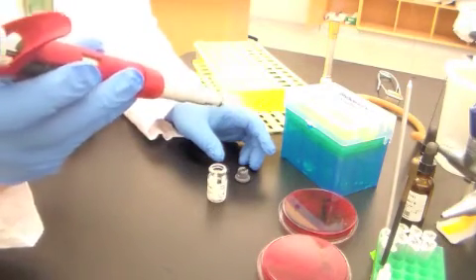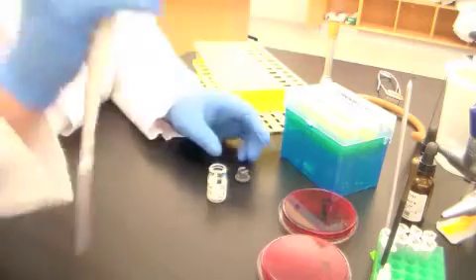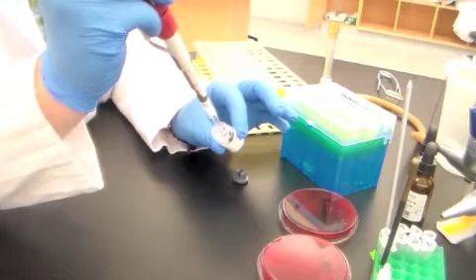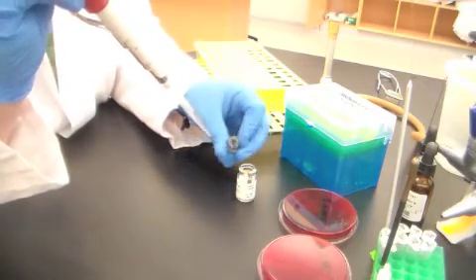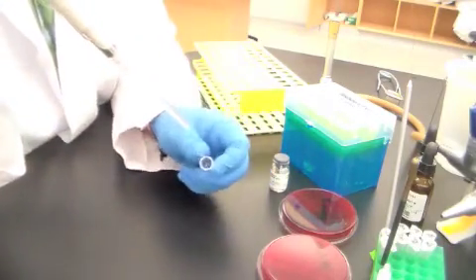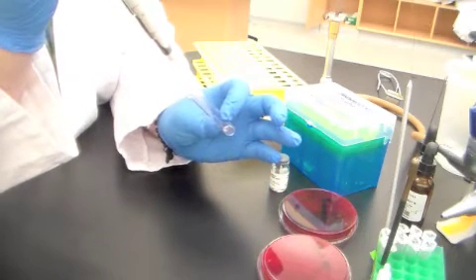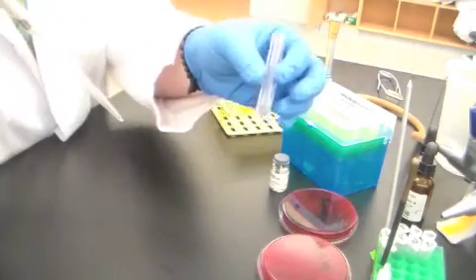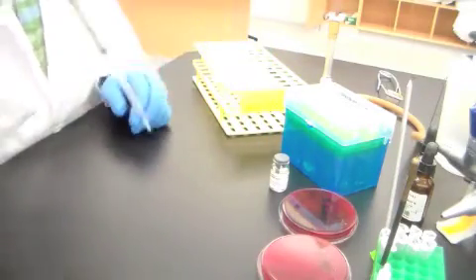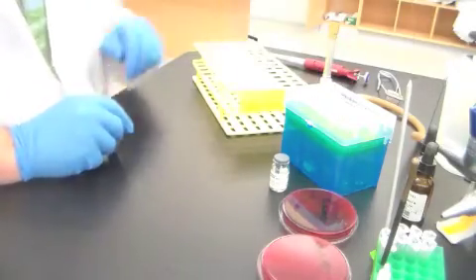There's a second stop to a pipetteman like this, so it's important that you know how to use it and how it's properly set. This is currently set for 500 microliters or 1/2 milliliter. I'm going to draw out 1/2 of a milliliter of this rabbit plasma and put the rubber cap back in. And I'm going to put this into a tube, and again, sterility is not important here. We're not going to culture anything. We're just looking for the presence or the absence of a clot. So I've added that 1/2 ml of rabbit plasma to that tube. And then I'm going to eject that pipette tip and set this pipette aside because I don't need it any longer.